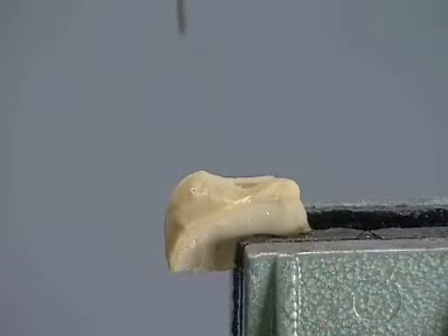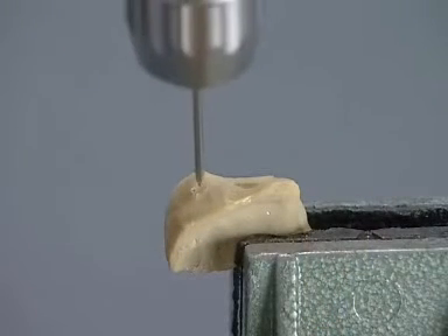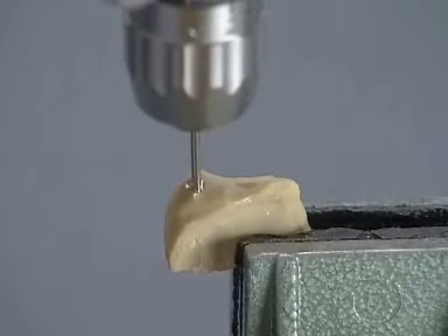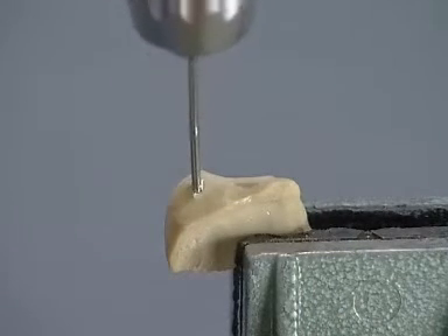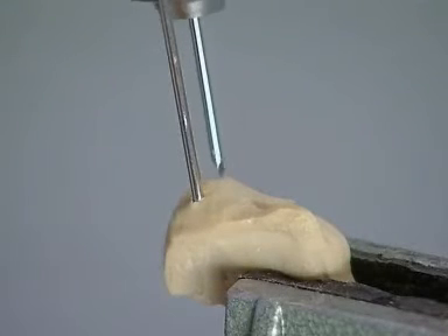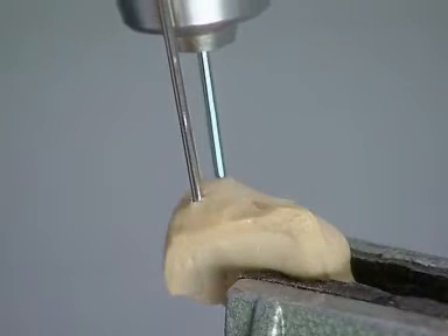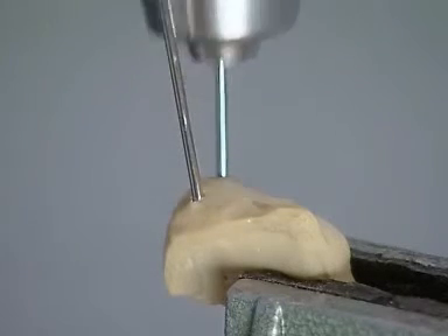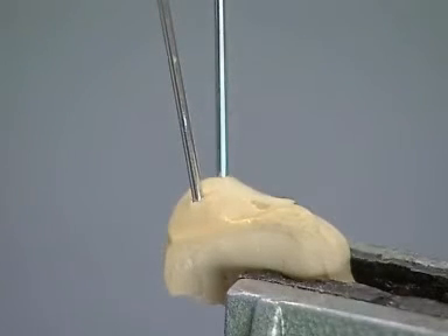Place the proximal fragment in the vice. Starting at the codal lateral point of the olecranon, drill a Kirchner wire, or K-wire, through the fragment until it penetrates the fracture site. Start a second K-wire at the codal medial point of the olecranon and advance it to the fracture site with the air drive. If necessary, withdraw the wires to a point just below the fracture surface.